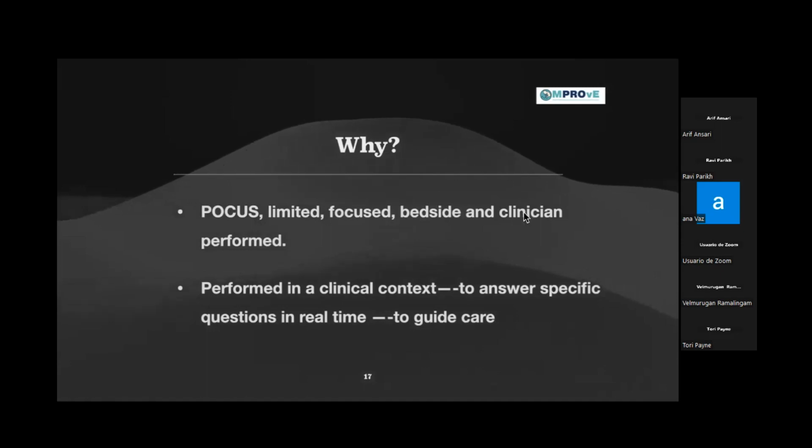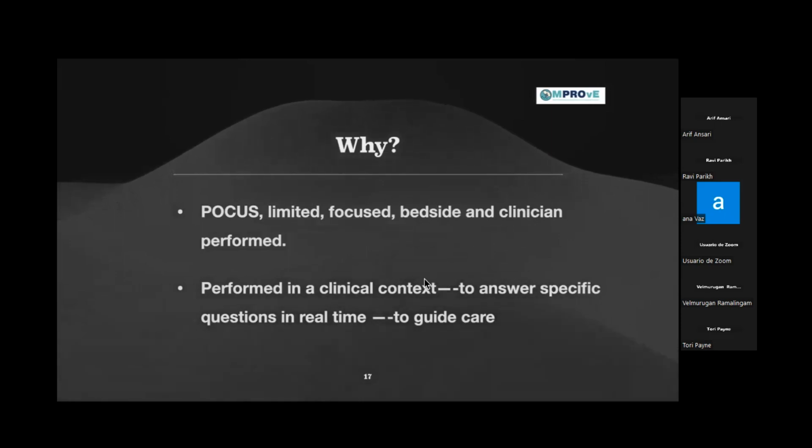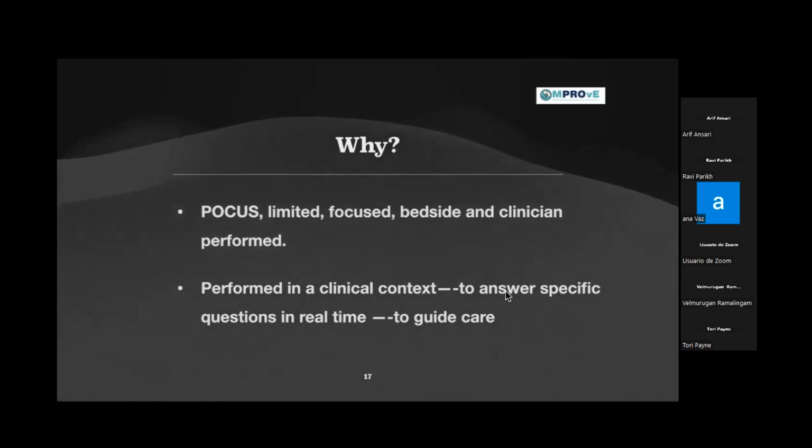So it is clinician performed, and it helps you tailor or individualize care for the babies. It is always performed in a clinical context to answer specific questions in real time, and it guides care. So you avoid doing multiple X-rays. If you don't have lung ultrasound skills, you might want to wait another 1 hour, repeat an X-ray, or see clinically if the baby's oxygen requirement is going up. You end up giving the surfactant to that baby.